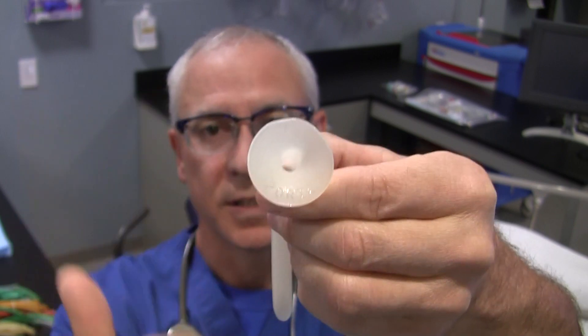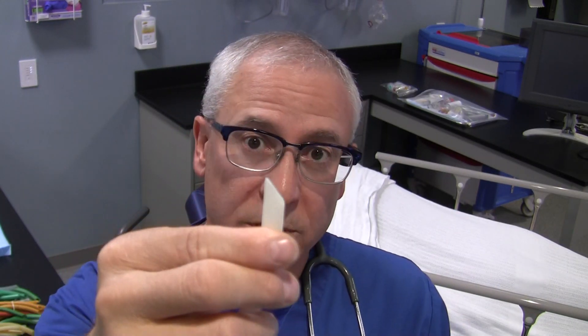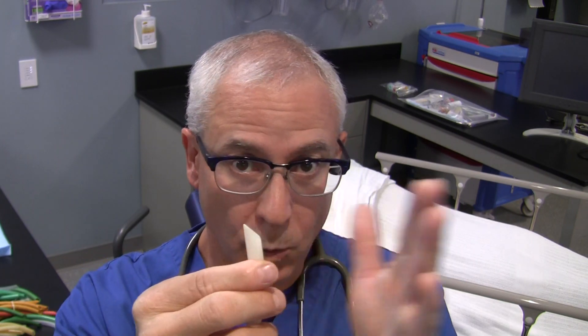The other part is the bevel. Now depending on which reference you look at, some say you should insert the NPA directed away from the nasal septum, or towards the nasal septum. My technique is to insert it towards the nasal septum because, given the way the turbinates lay inside the patient's nares and nasal passages, you usually do a little bit less damage when inserting the NPA with the bevel facing the septum of the patient.